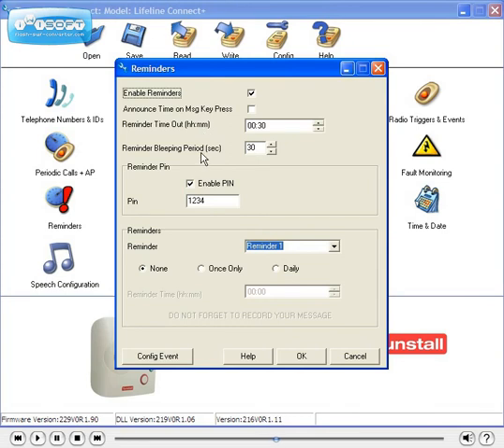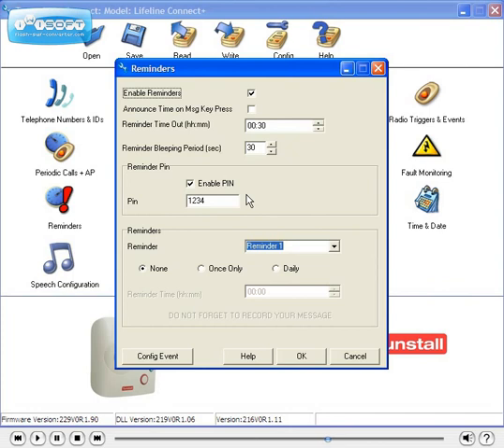The reminder pin allows you to set a pin that is required to be entered when setting a reminder on the Lifeline Connect Plus home unit. This can be entered in a little box as shown. In this example, we will change it to 7890.